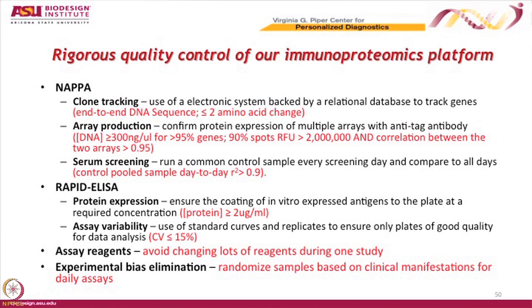And there are subtle variations to this. Maybe you do everything the same day, but you load the cases first, and then you load the controls second. And so the first ones that run through the machine are the cases, and then the next ones that run through the machine are the controls. So you have to make a concerted effort to make sure that you mix up everything, that there's an even distribution of cases and controls in every step you do, and that there is no order bias or plate bias or day bias to the cases or controls, or else you will end up chasing your tail. You'll think you found something really good, and then you'll discover a year later, after investing all of your time in it, that it was an error because you just didn't load them in the right order.